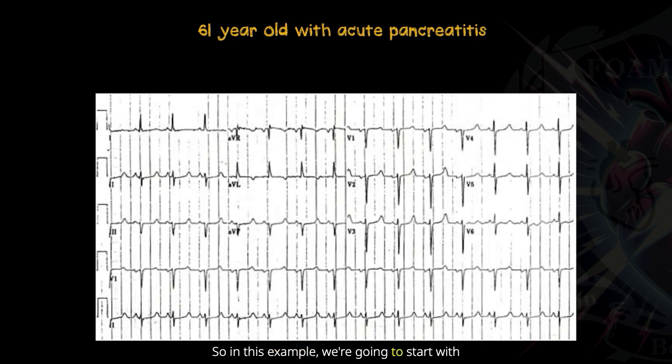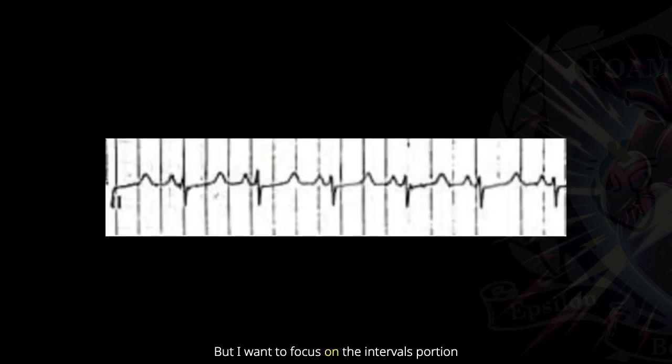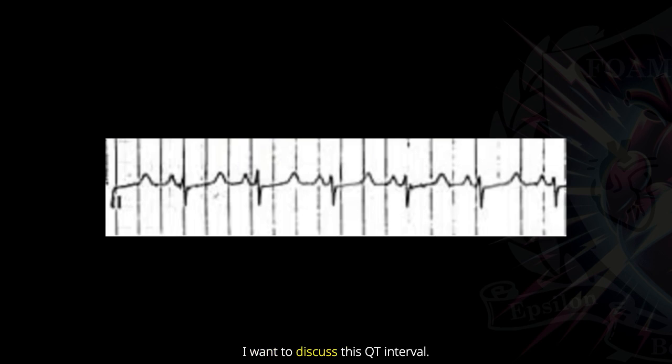In this example, we're going to start with a 61-year-old male with acute pancreatitis. I want you to go through your normal rate, rhythm, axis, intervals, or whatever methodology you use to go through 12 leads. But I want to focus on the intervals portion of this, and we're going to zoom in a little bit to discuss this QT interval.